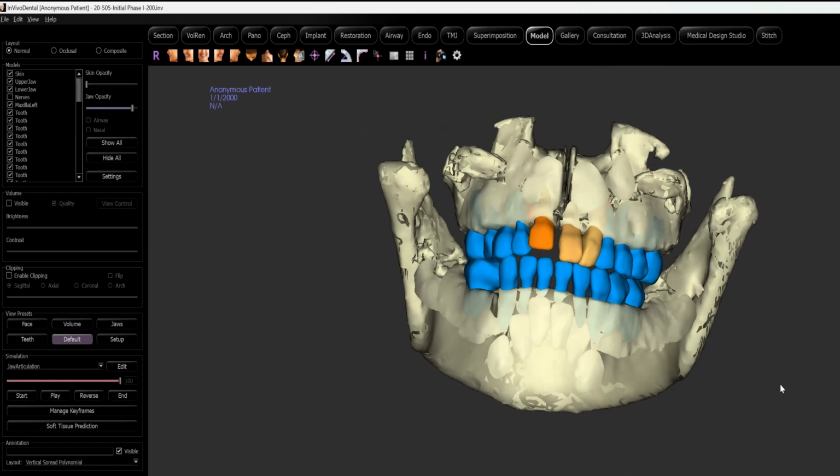They don't have osseous boundaries, right? So one of the great advantages of doing virtual simulations here is the ability to understand the confines of those osseous borders, okay? So there are many, many advantages to the in vivo model. I just wanted to show you an example of what that in vivo model is, all right?